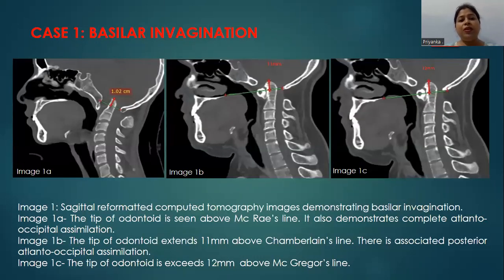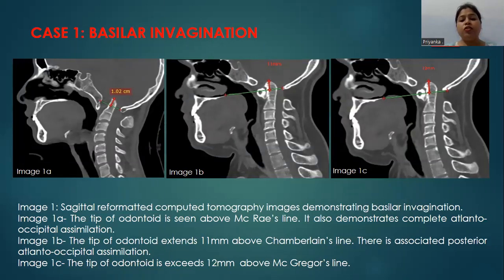This case demonstrates basilar invagination. In image A, the tip of the odontoid is seen above the McGrae line. In image B, the tip is above the Chamberlain line, 11 mm above the Chamberlain line. And in image C, it is 12 mm above the McGregor line.